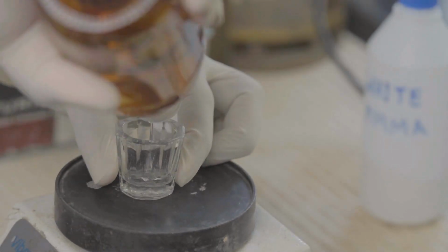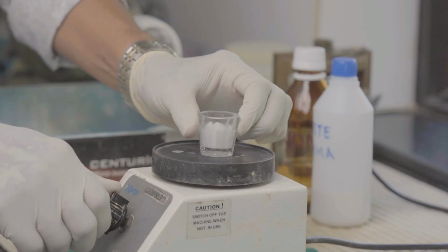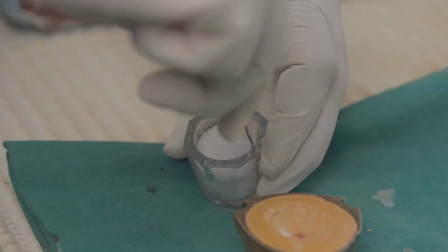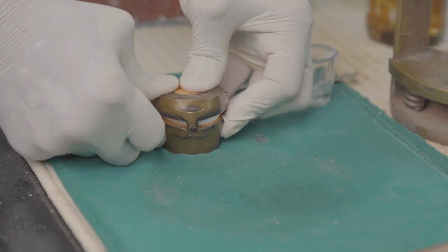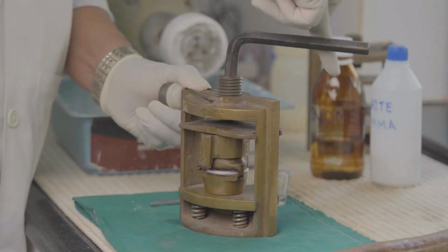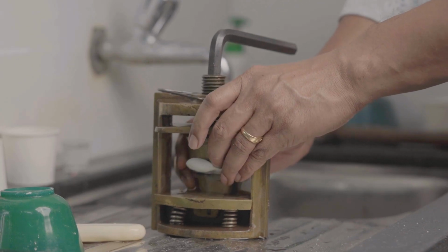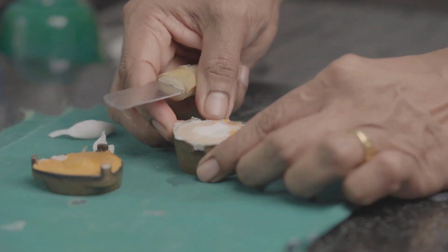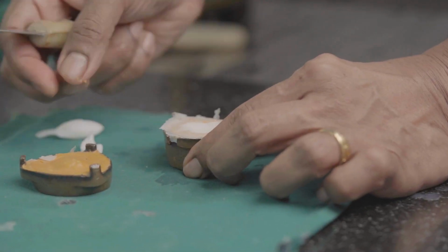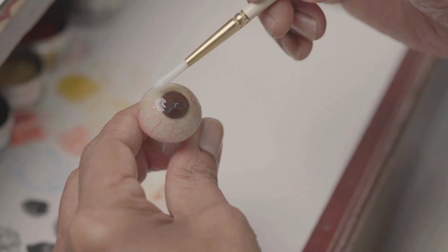In a short glass, white PMMA powder is mixed with monomer liquid to form a dough. The white PMMA mixture is placed in the plaster mold and the two halves are put together and placed in the bench press so that extra plastic leaks out. This is placed in the water bath for 45 minutes at 100 degrees centigrade. Once this curing is done, the scleral shade plastic is taken out, the stem of the corneal button chipped and the surface smoothened. The scleral painting is done.